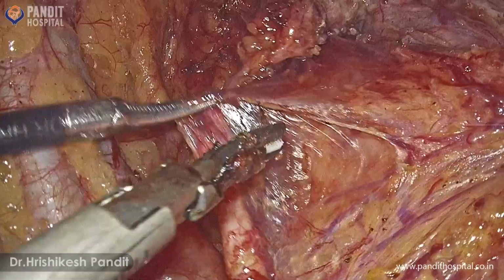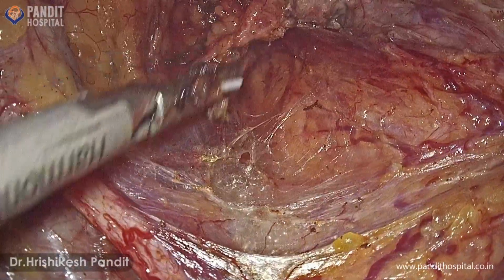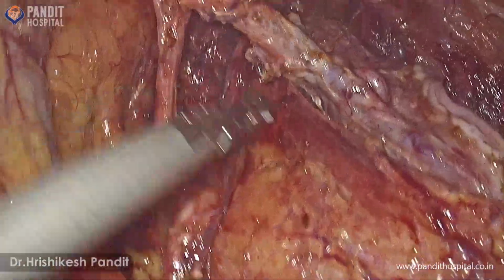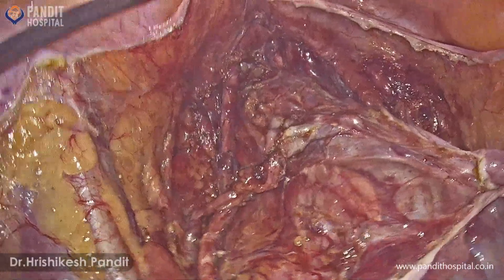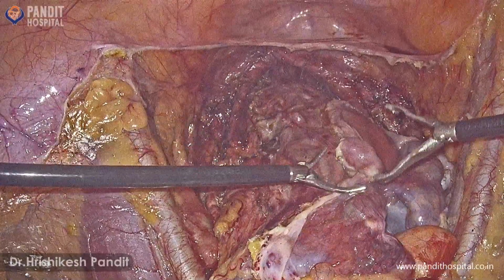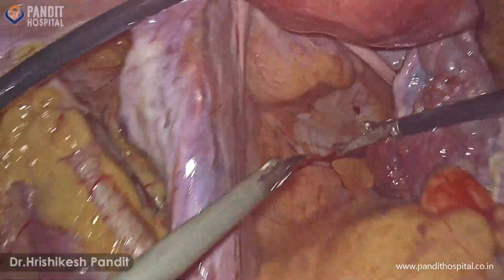Now we are dissecting the ureter off its broad ligament attachment. We can see the entire ureter dissected till the bladder with intact left uterine artery from its origin. Now we will open the recto-vaginal space.